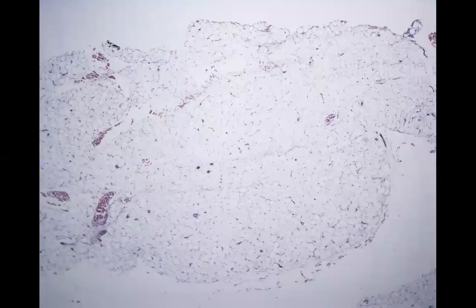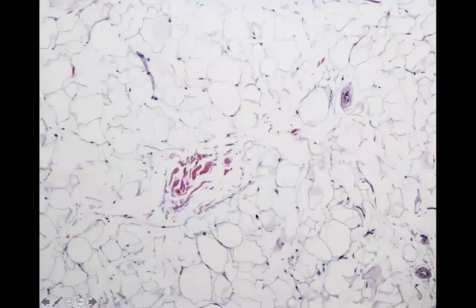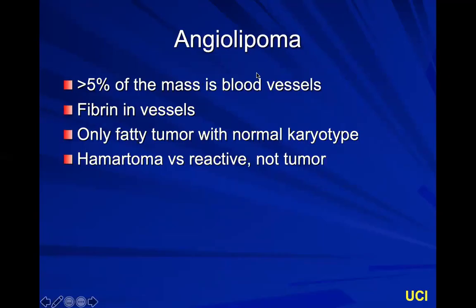The most basic fat tumor is a lipoma, where you'll see sheets of mature adipose tissue — it almost looks like a blank slide. You should have very thin septae between these mature adipose cells, and they should all be relatively even in size. You can see a little nucleus in each one — it's just a mature adipocyte.